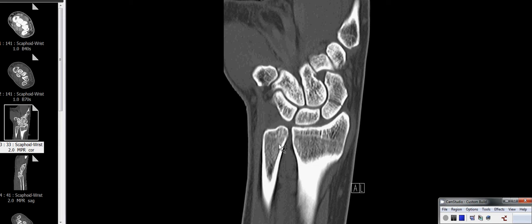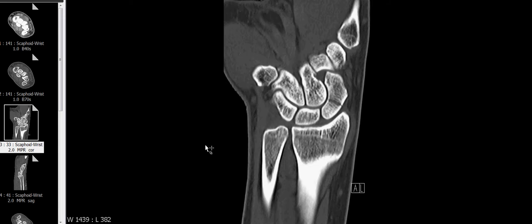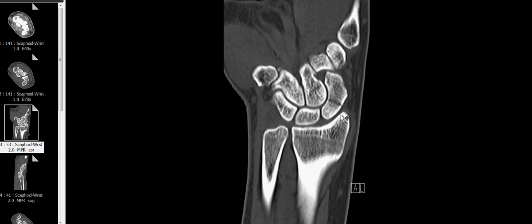I wanted to give credit to a very well done CT of the wrist and to show why it's well done, and to explain image plane prescription and so forth. This CT was done to evaluate this scaphoid fracture that you can see here.